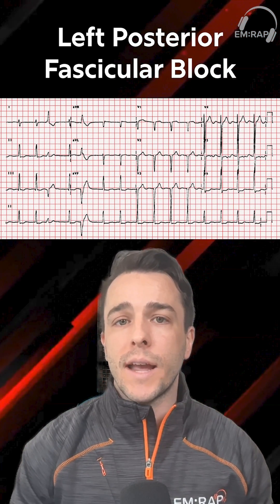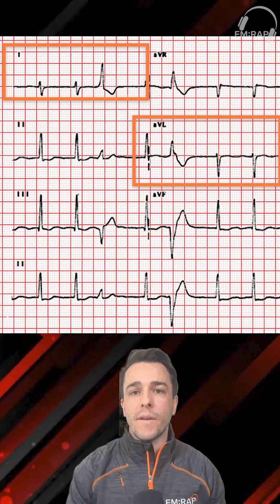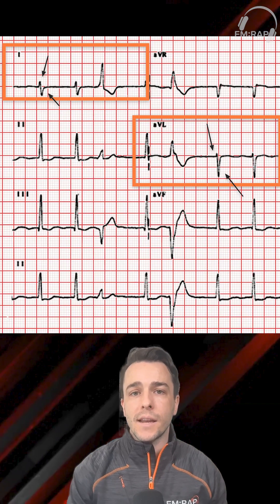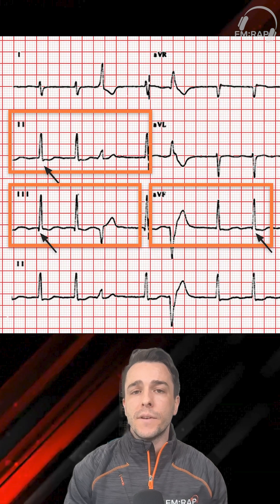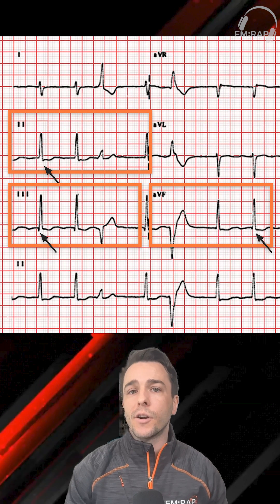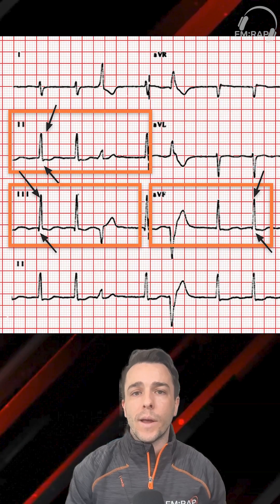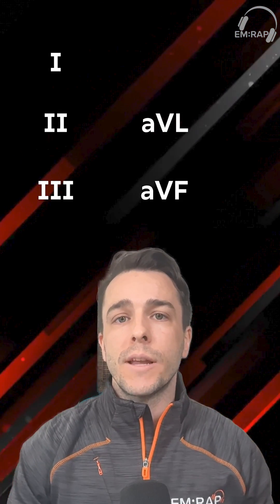I remember the left posterior fascicular block as the opposite. In leads I and AVL, we have a small positive deflection in our R wave and a large negative deflection in our S wave. Then in our inferior leads, we have a small negative deflection in our Q wave and a large positive deflection in our R waves. Think of them as opposites, grouped by the lateral leads (I and AVL) versus the inferior leads (II, III, and AVF).